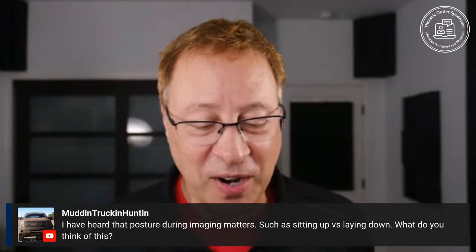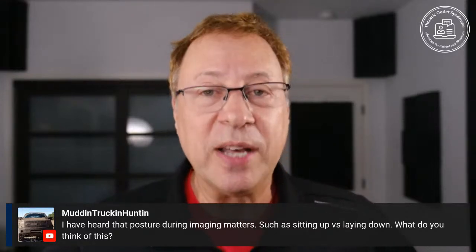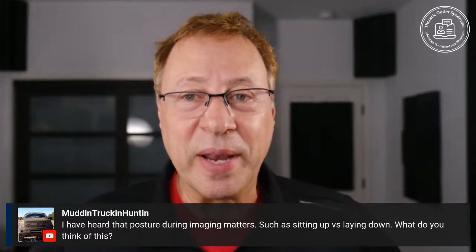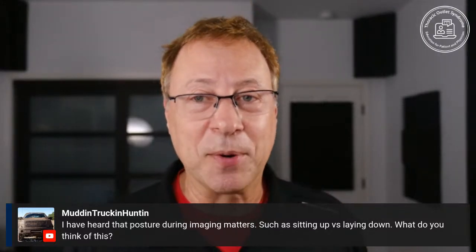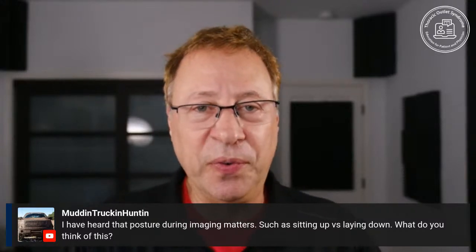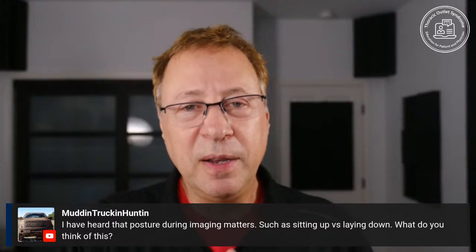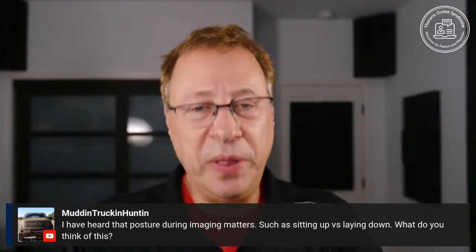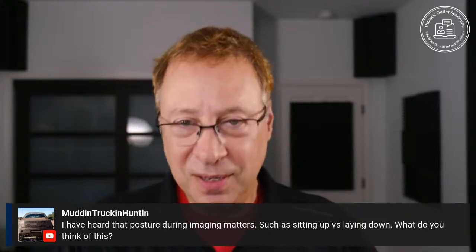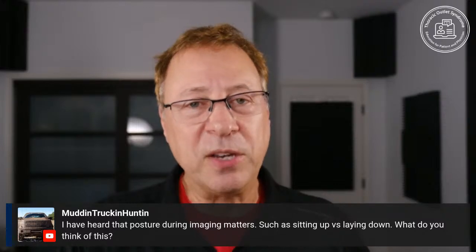All right, hey, Muddin' Truckin' Hunting's back. I have heard that posture during imaging matters, such as sitting up versus laying down. What do you think of this? What I think is that's a great question. I actually was just looking at a paper today. When they did direct catheter angiography in the 1960s, several people published papers showing that laying down patients with this contrast going through a catheter versus sitting up patients getting the same test, there was more arterial compression when the patients were sitting up.